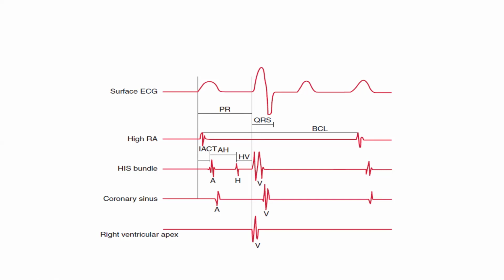Do you know that you can also convert it to time? Remember that each big box is 0.2 seconds, that's 200 milliseconds, right? Yes, sir. So your same RR interval, you can convert it to milliseconds, right? Yes, sir. So it's something you can do yourself.